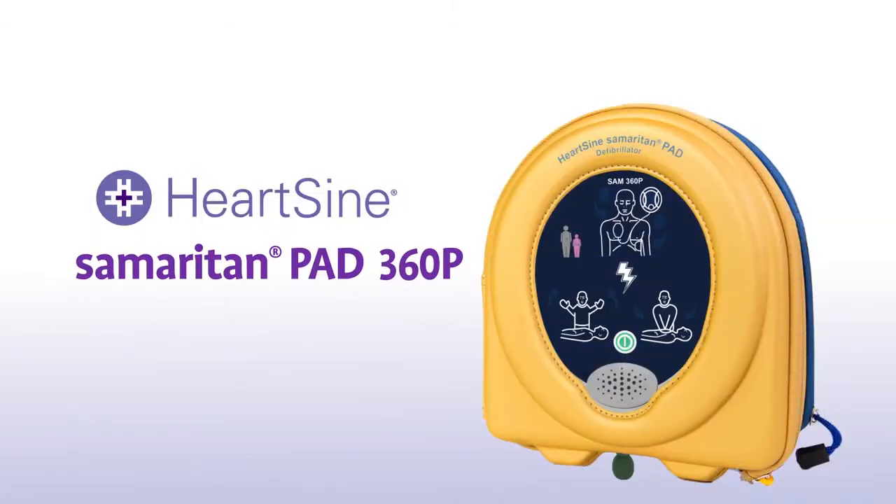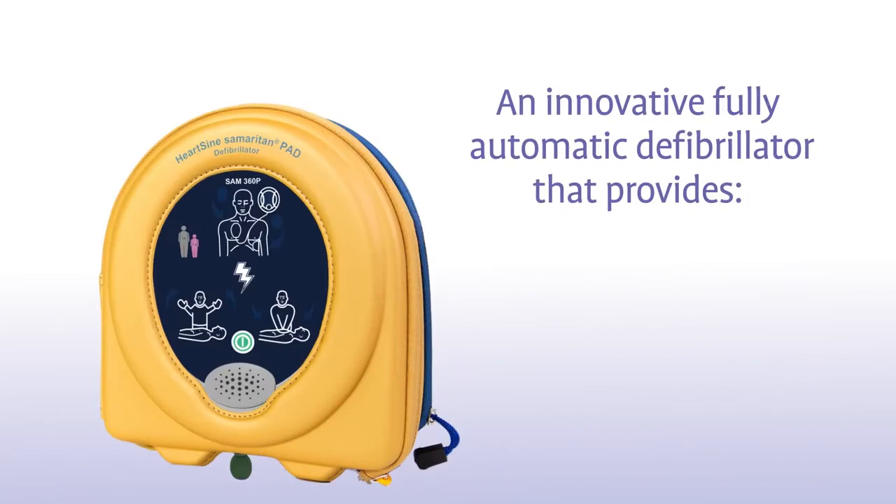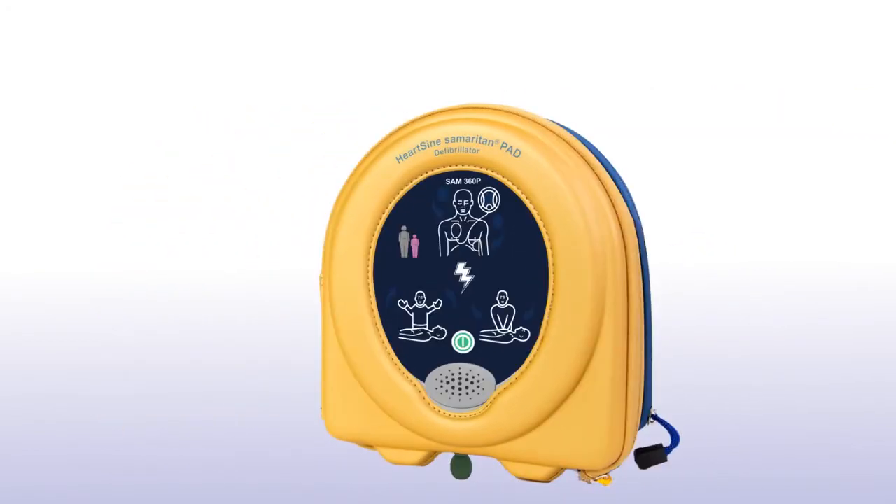HeartSine Samaritan PAD 360P — an innovative, fully automatic defibrillator that provides audio-visual CPR coaching. Let's look at how to use one in a life-saving situation.